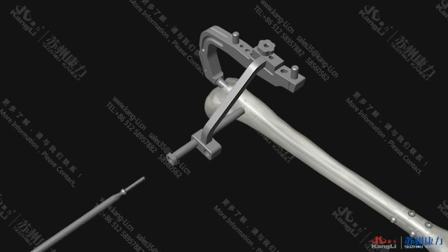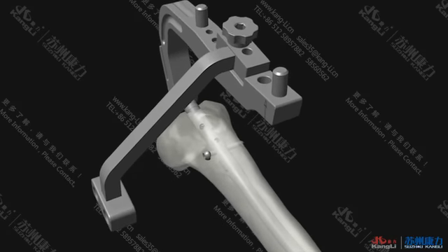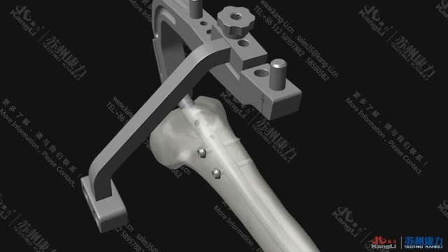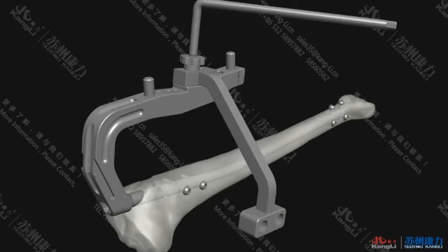Choose the phi 4.5 locking screw with appropriate length and screw it in with the 3.5 hexagonal screwdriver. Repeat the steps described above to finish the placement of the second locking screw. Remove the proximal targeting bracket.